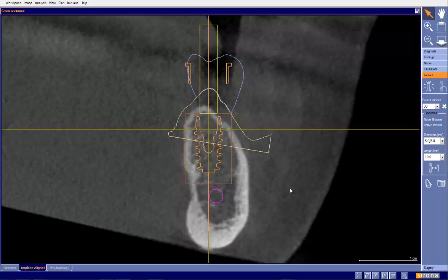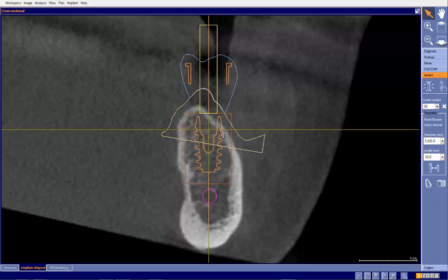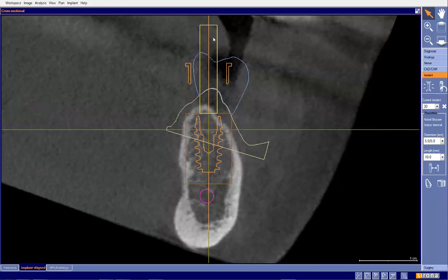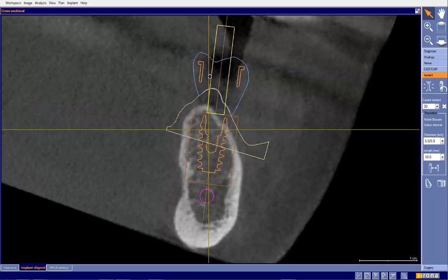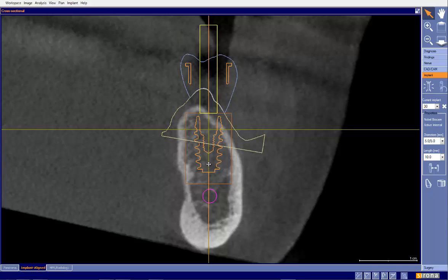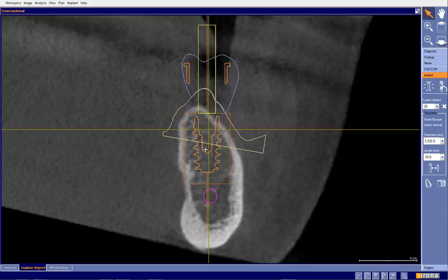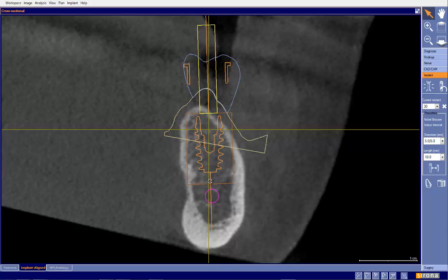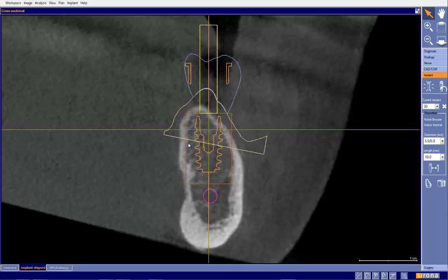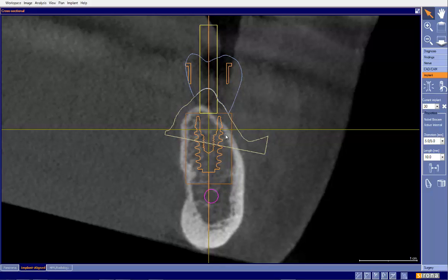We can see that our space here is much thinner than our space on the other side. My initial impression is that we want to fix this. We can shift the implant buccally, but that brings grafting into the case. We can go back lingually, but that brings offloading the restoration into play. Experience tells me we can re-center it like so, which will give us a little better centering, though it will still bring some grafting into place.